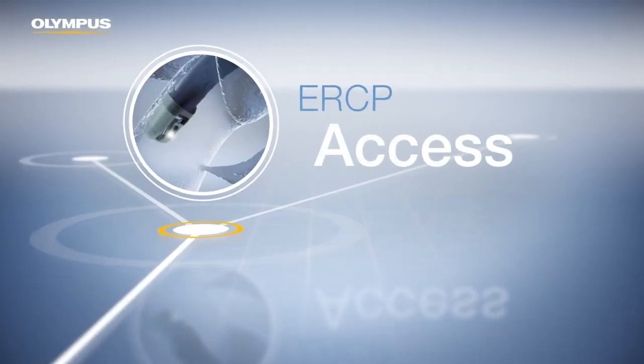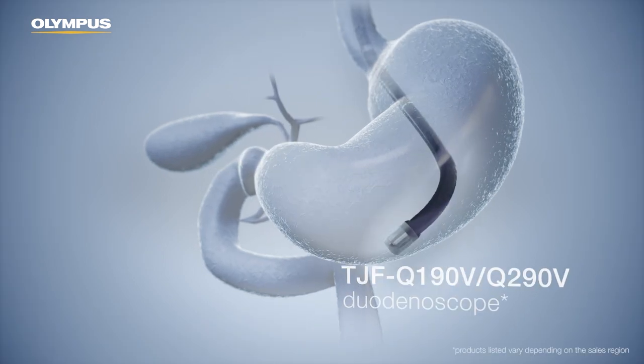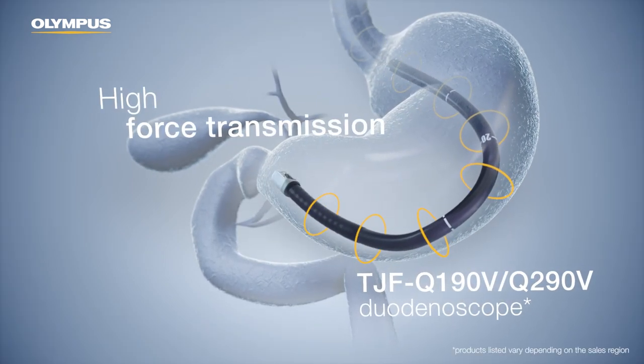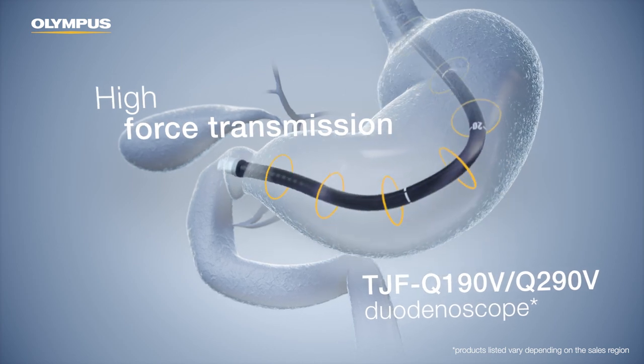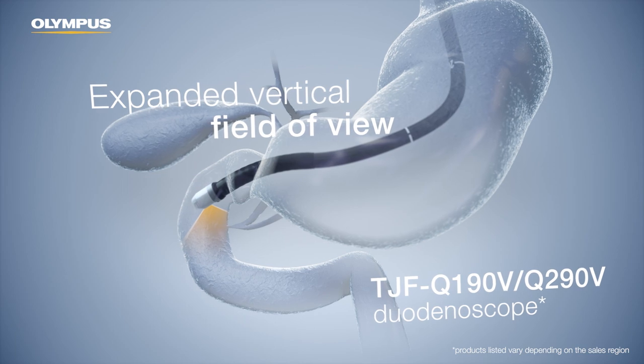Gaining access to the desired duct is the first essential phase of ERCP. The duodenoscope provides enhanced scope responsiveness and an expanded vertical field of view for cannulation efficiency.